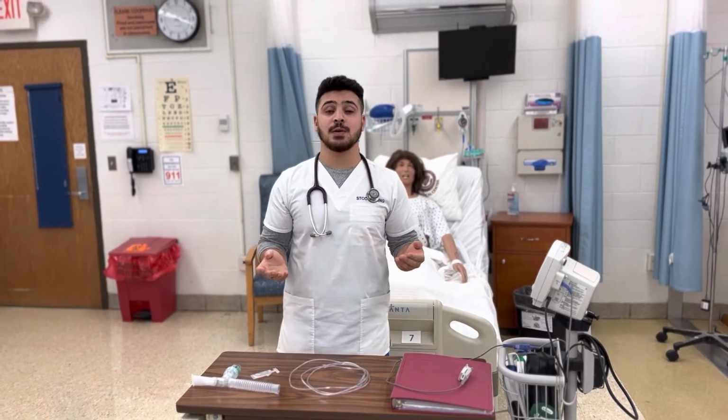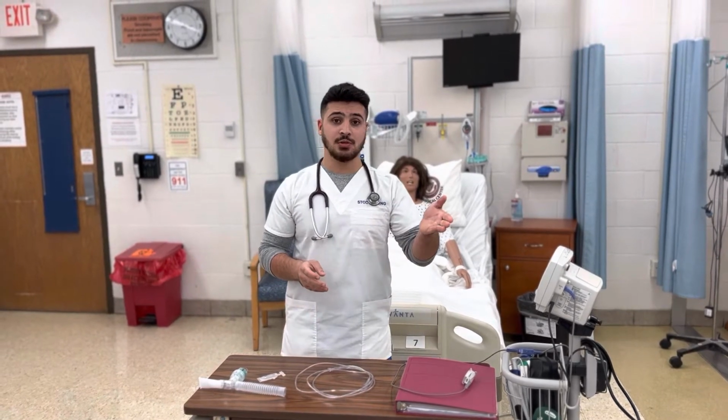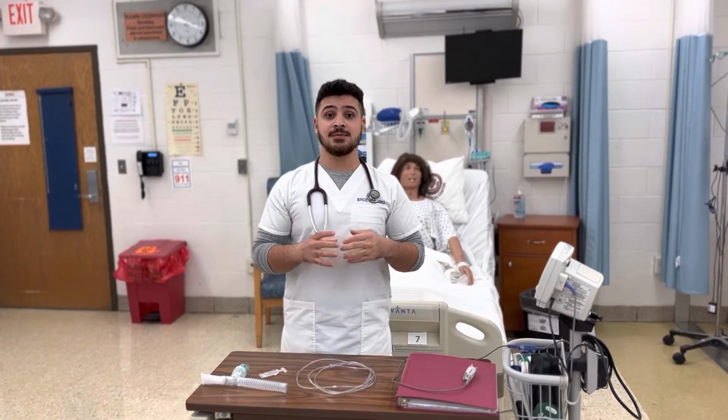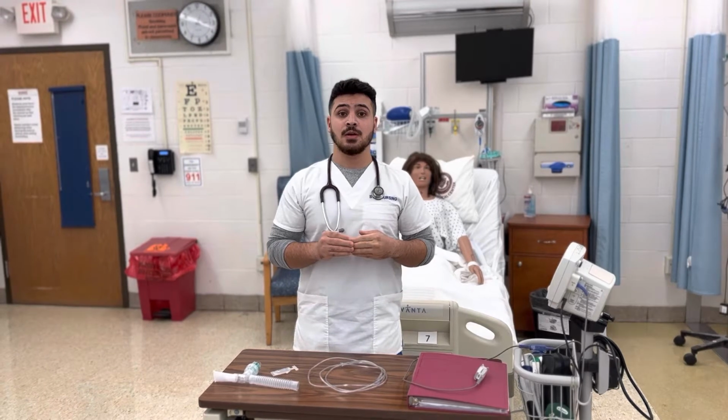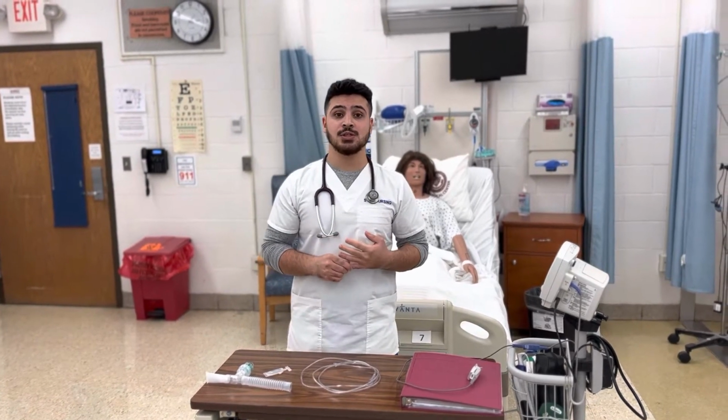Does anybody here know what a nebulizer treatment is? A nebulizer treatment is a device that delivers a small amount of medication through the airways. And I'm sure that most of you have dealt with or lived with someone who has a respiratory issue or asthma.